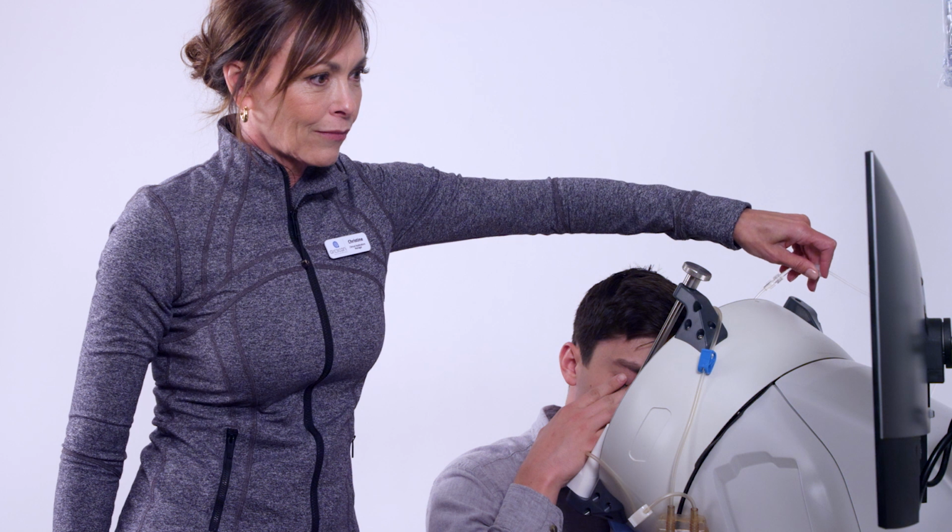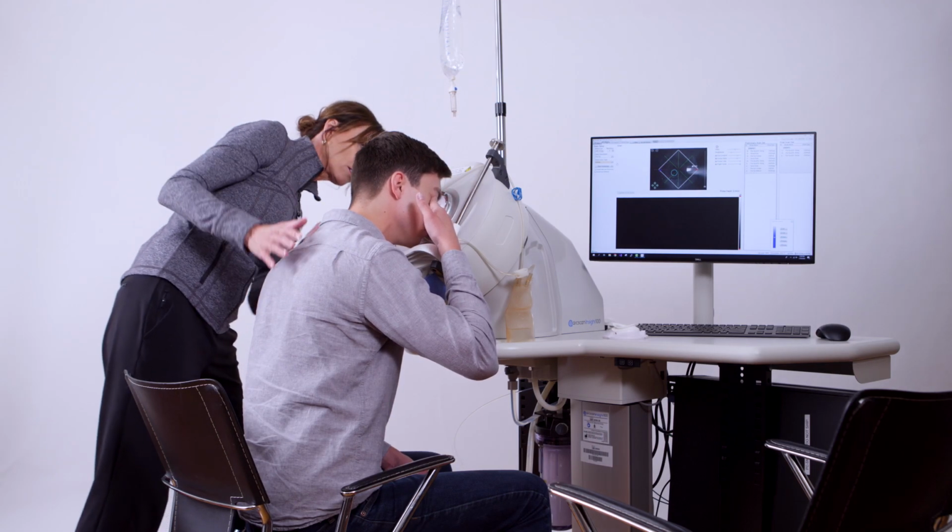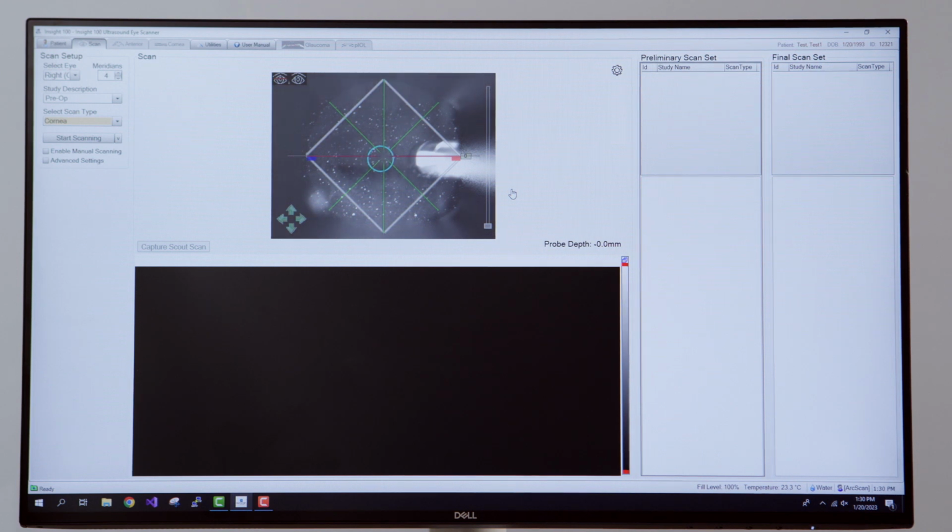Some patients find that it's helpful for you to place a hand on the back of their head because the water's cool and they may instinctively want to pull back. Monitor the camera view.